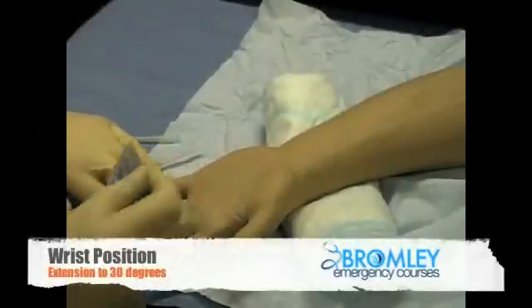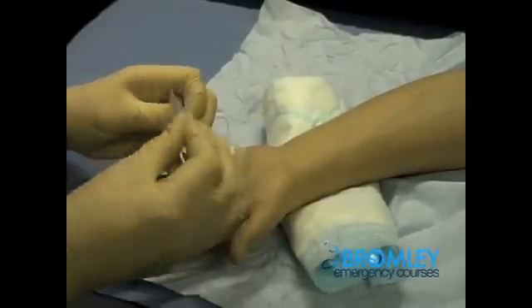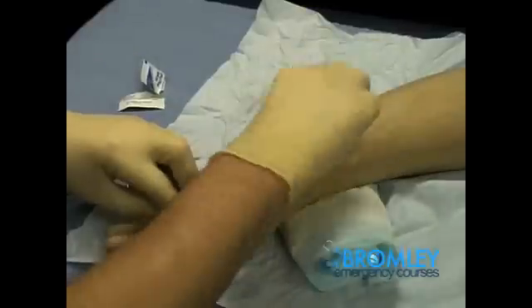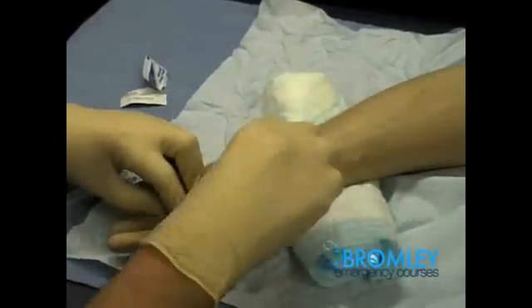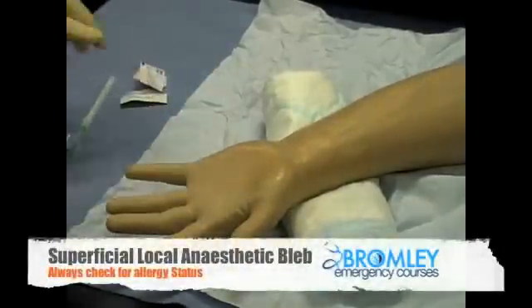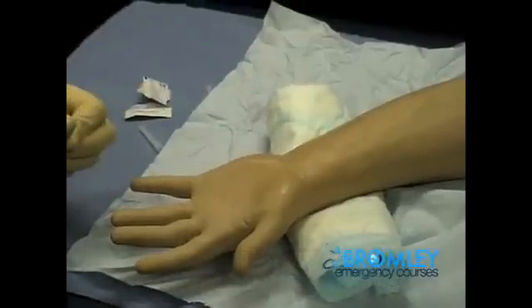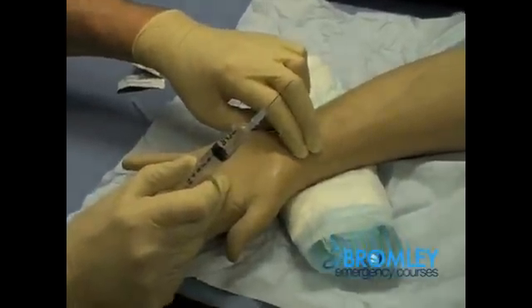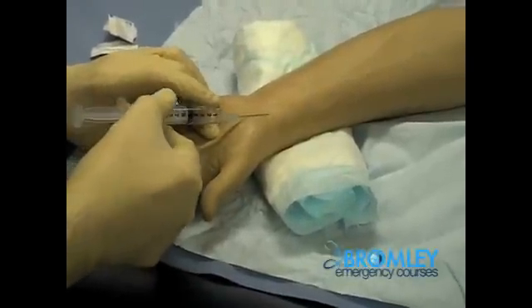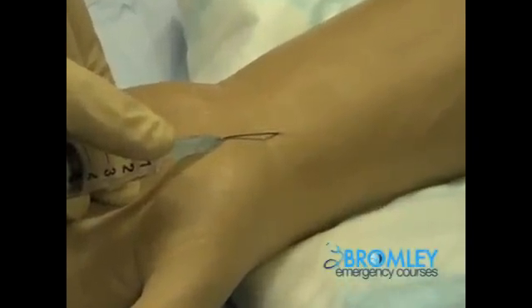Having slightly extended the wrist with something placed beneath the wrist, we then clean the area around the radial artery with a suitable disinfectant, betadine or spirit. We should then infiltrate with a local anaesthetic. Using a small gauge needle, we feel over the radial artery until we can feel the radial pulse, and then we raise a small bleb of anaesthetic just underneath the skin over the radial artery.